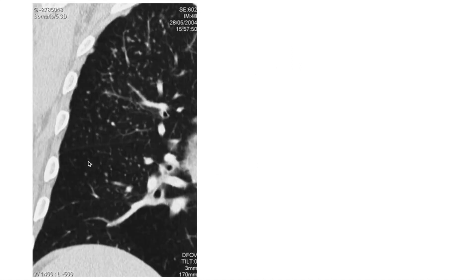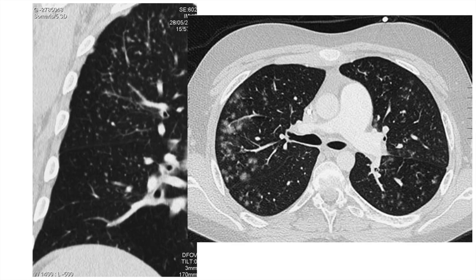Here we can see multiple nodular opacities especially in the upper lungs. This is pneumoconiosis, where the nodules are sharply demarcated. In contrast, diffusely demarcated nodules are seen in mycoplasma pneumonia, where the nodules have less sharp borders.